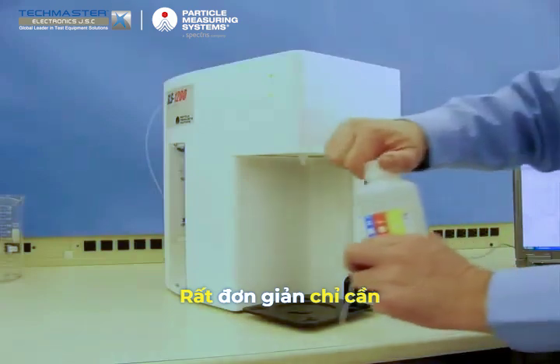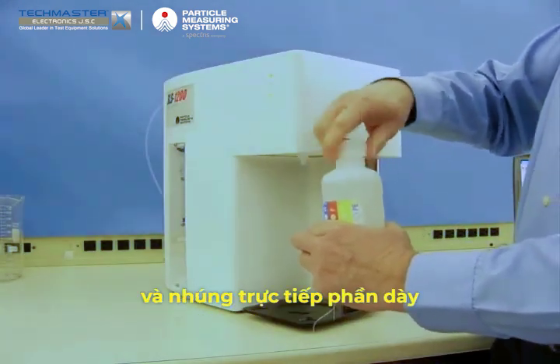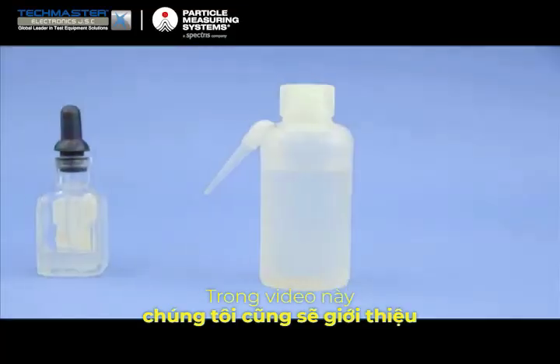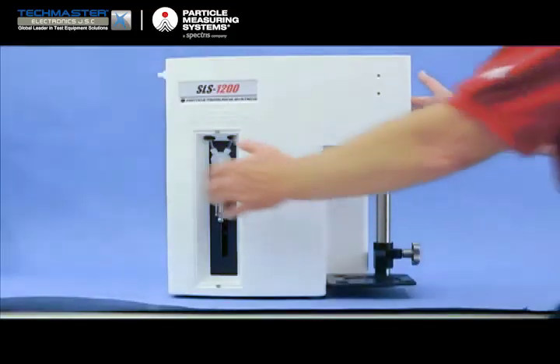One option to wet the floss would be to remove the lid of the pre-mixed bottle and dip the fat section into the solution inside. For the purposes of this video clip, 2 other alternative methods to wet the floss will also be shown.